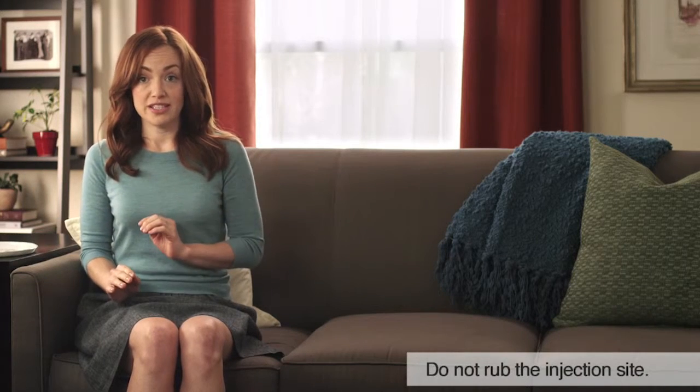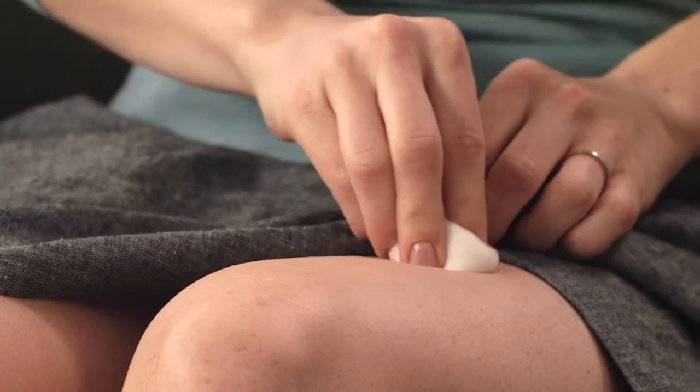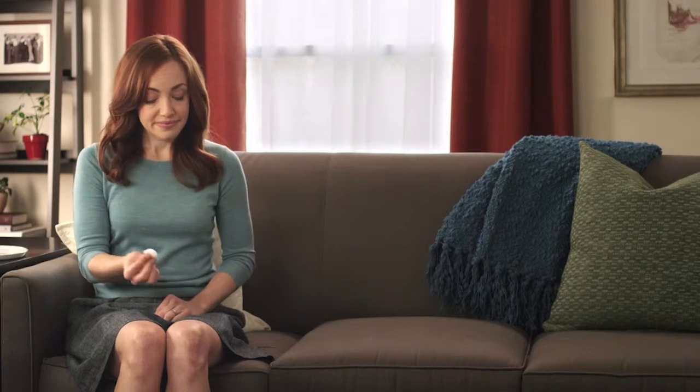Don't rub the injection site. Instead, gently press the gauze or cotton ball for 10 seconds. There may be a small amount of fluid or a drop of blood, which is normal. At the injection site, there may be redness, rash, swelling, itching, or bruising. If it doesn't go away within a few days or gets worse, call your doctor right away. All right, we're just about done.